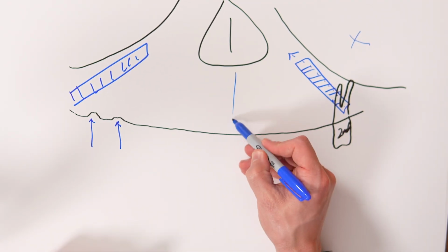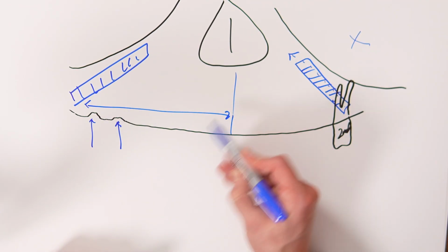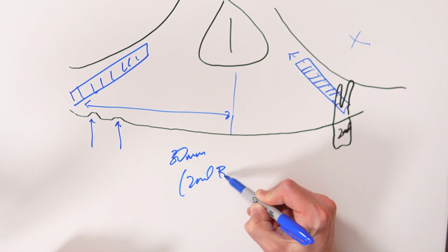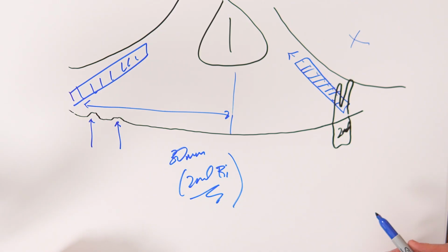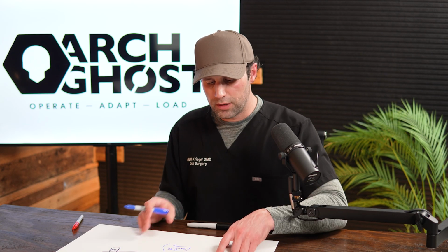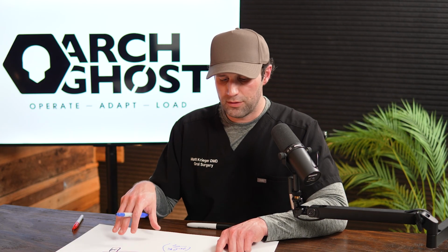If I have concern, I can measure like we talked about. Okay, this is 30 millimeters. I know that's a second bi. Okay, so I'm good from that standpoint. So being able to see and utilize those defects is, again, there is not a better guide. You can fabricate your own guide, and you want to have as much accuracy as that. That provides you everything you need.